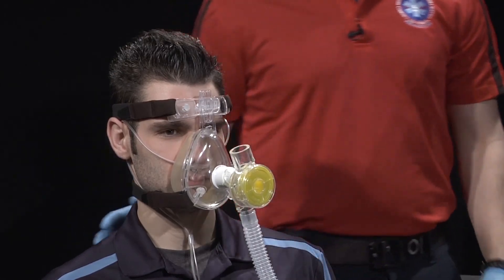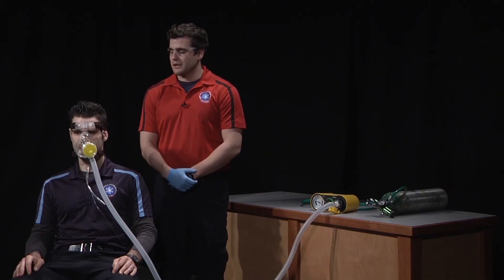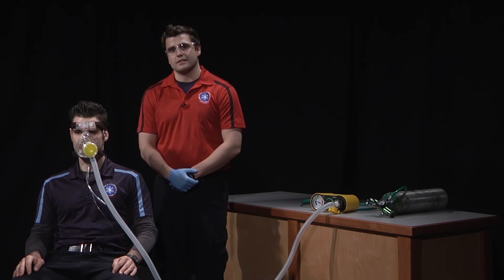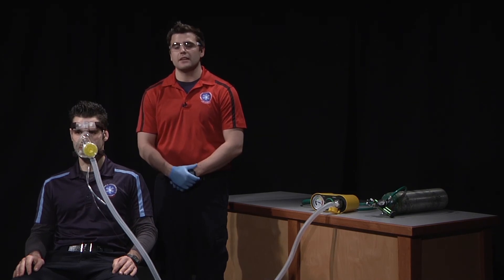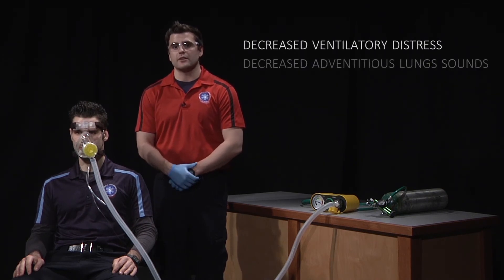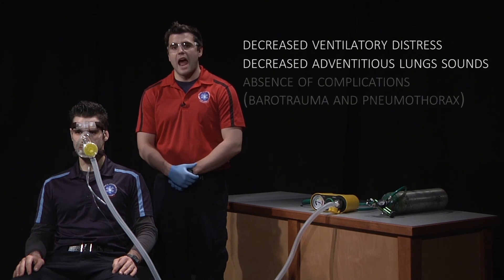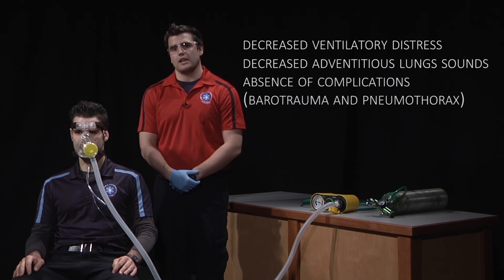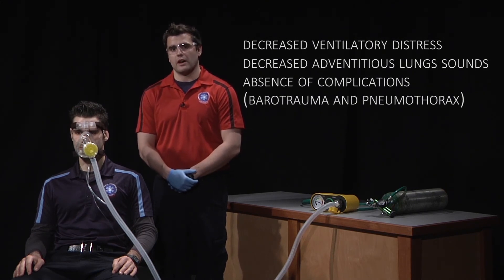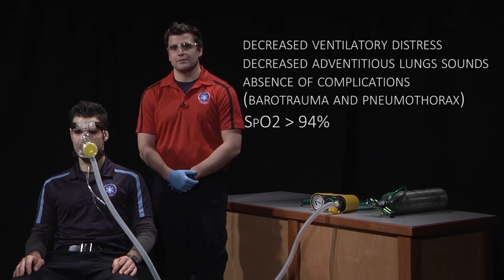After the CPAP mask has been placed appropriately, we're going to frequently assess the patient for desired effects, such as decreased ventilatory distress, decreased adventitious lung sounds, absence of complications such as barotrauma and pneumothorax, and an SpO2 greater than 94 percent.